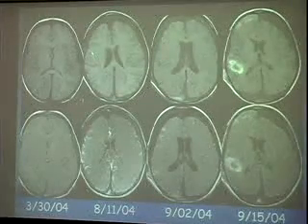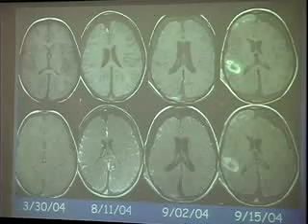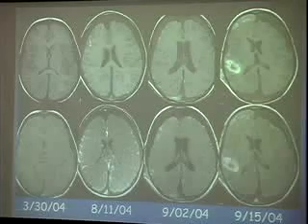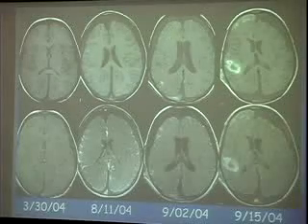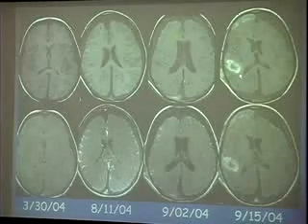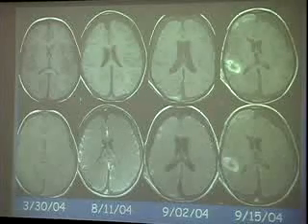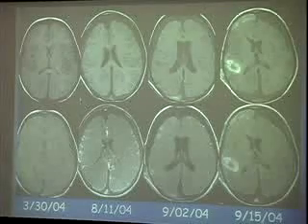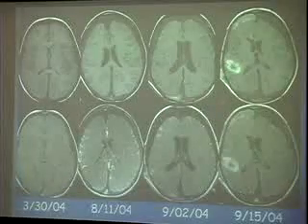As we progress over time, we see bright T1 signal from blood products. When we see white signal on these images, the blood products are at least three days old. We progress from leptomeningeal enhancement and effusions through hemorrhage in the leptomeninges and punctate areas of hemorrhage at the gray-white junction. On post-contrast imaging, there is a variable but fairly diffuse leptomeningeal enhancement that peaked at one study and became less over time. The cerebellum was also involved in hemorrhages that occurred between studies.